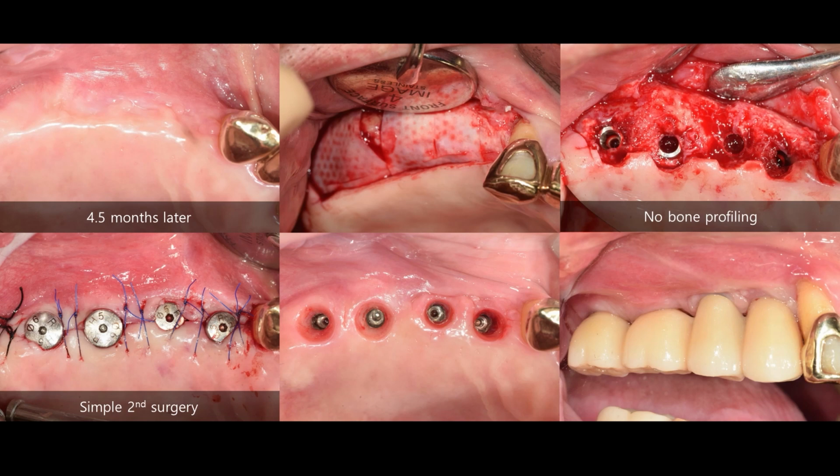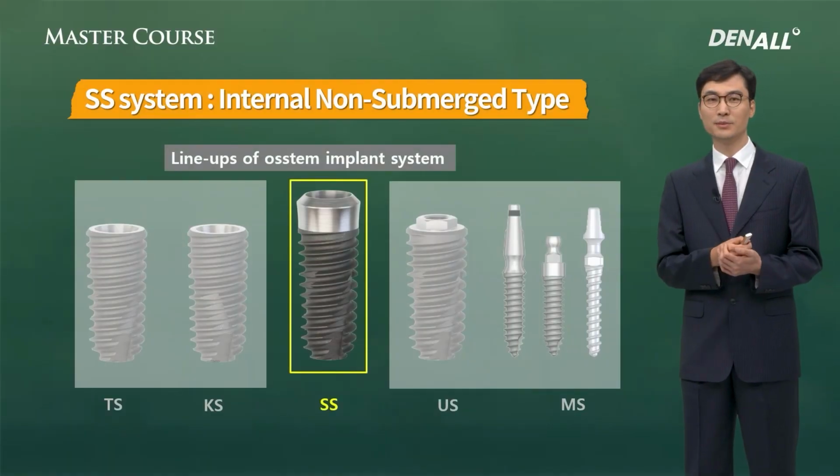So you need to remove the bone to a certain degree to connect the healing abutment, facilitating the surgery. Therefore, if it is not deeply placed, the bone profiler doesn't need to be used, so that the second surgery can be completed very simply, a very big advantage when it comes to surgery.